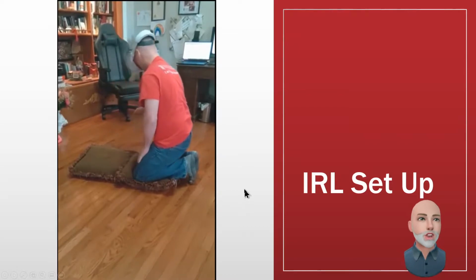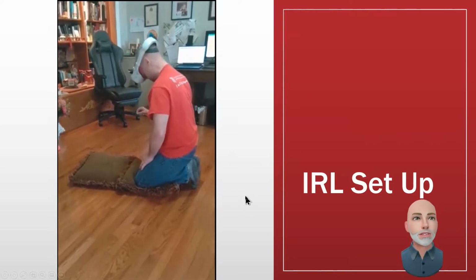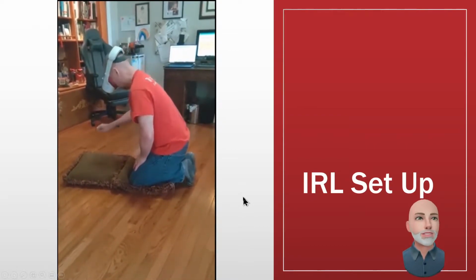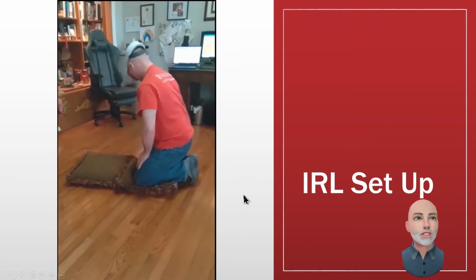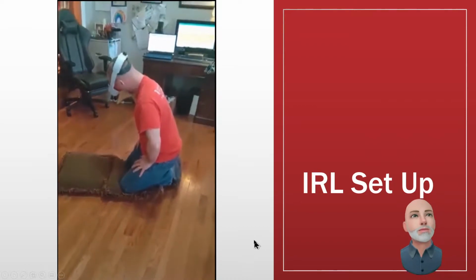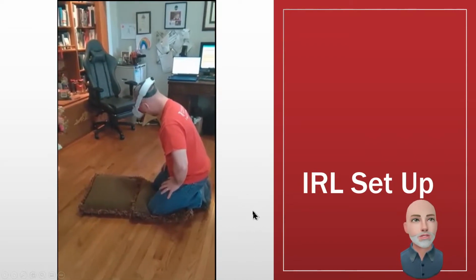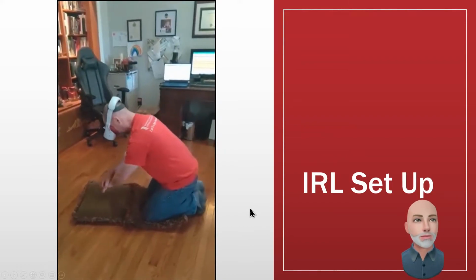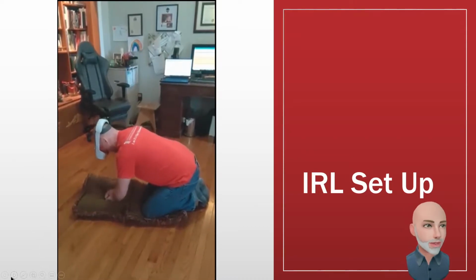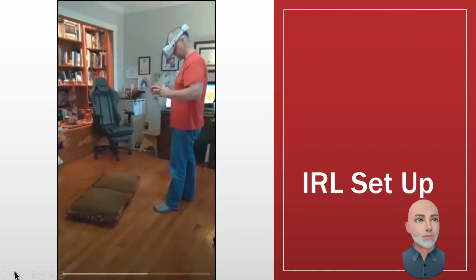Now here it's pausing me to apply and use the AED. So you can see me putting a patch on one side of the chest, and putting a patch on the other side of the chest. And then the AED is going to get a reading, and then it's going to give a shock and tell me to continue CPR. And it gives you the hand placement, and there I go. Okay, enough of that. Just wanted to give you a sense of how you might want to set this up.